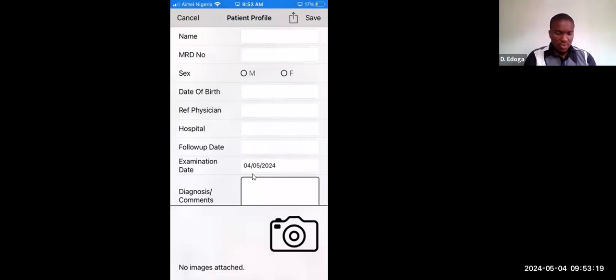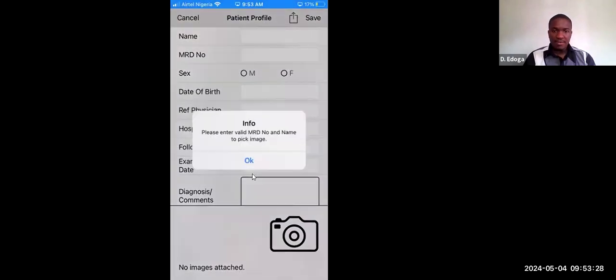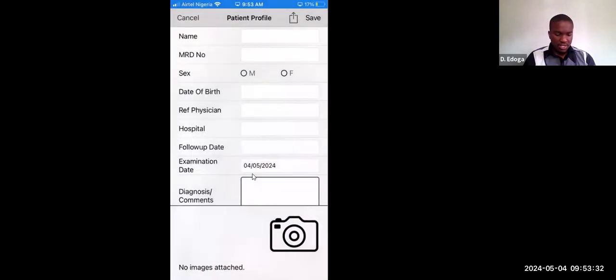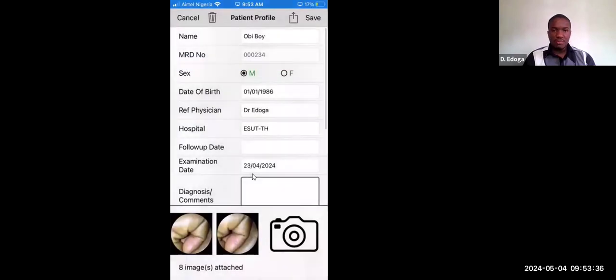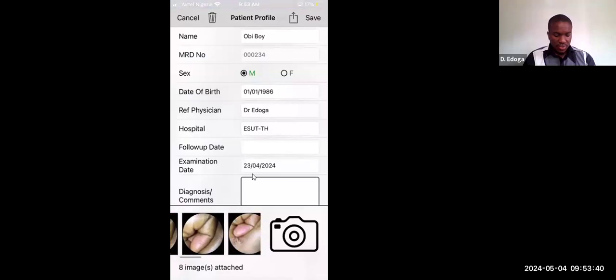All right. So here you can fill in details of the patient. Then you now click on the camera sign. So because of time, I'll just go back to what I've been able to do. So this is just an imaginary patient that I checked.